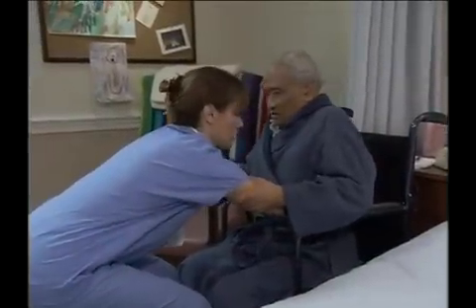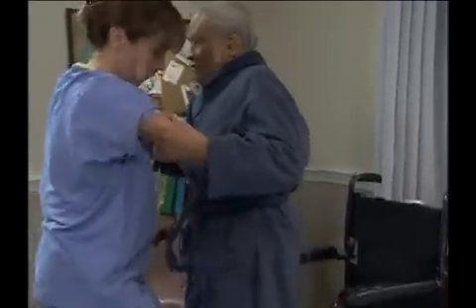If use of a transfer belt is contraindicated for your patient or resident, you can assist the person into a standing position using a different technique. Place your hands on the person's upper back and gently pull him up and forward as you straighten your knees. No matter which method you use to assist the person out of the chair, remember to keep your back straight as you are doing it.